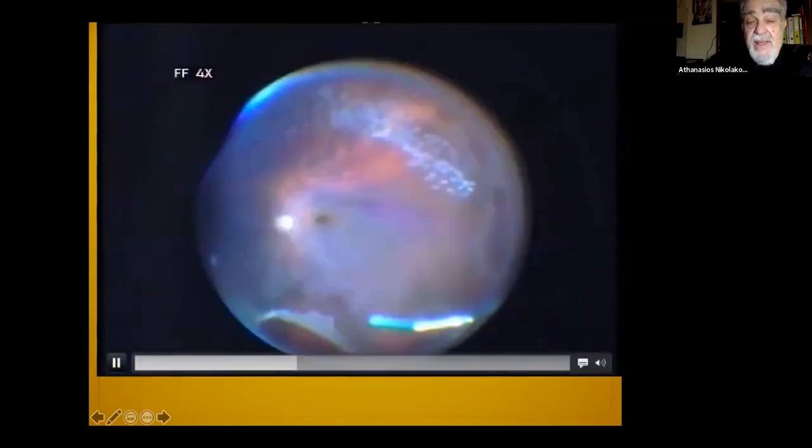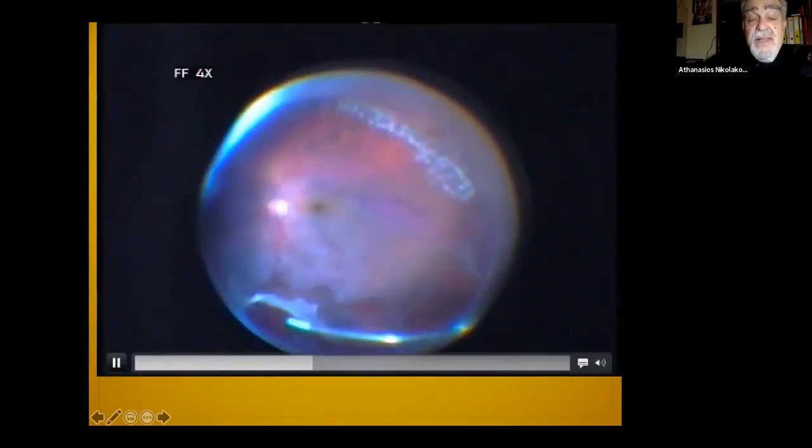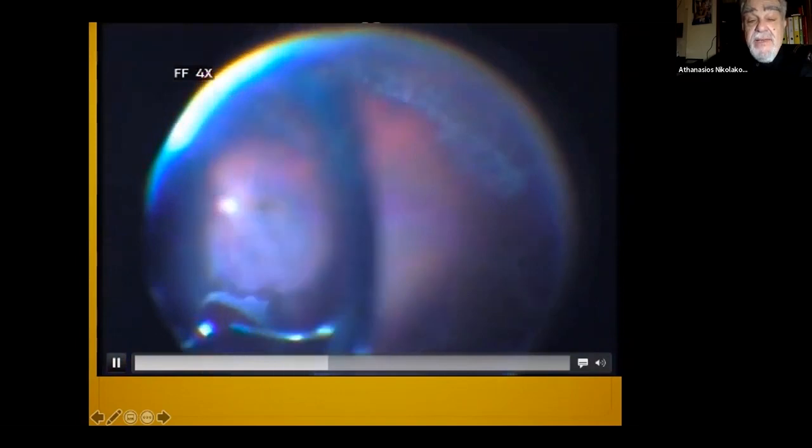Here I can show you a small video while doing surgery, and these tears you can see here are in the attached retina. It's one after the other like soldiers. So this is the attached retina where I do laser on multiple tears that, if they are connected, can become a giant tear. And then I'm going to the retinal detachment and you can see the tears in the same plane.